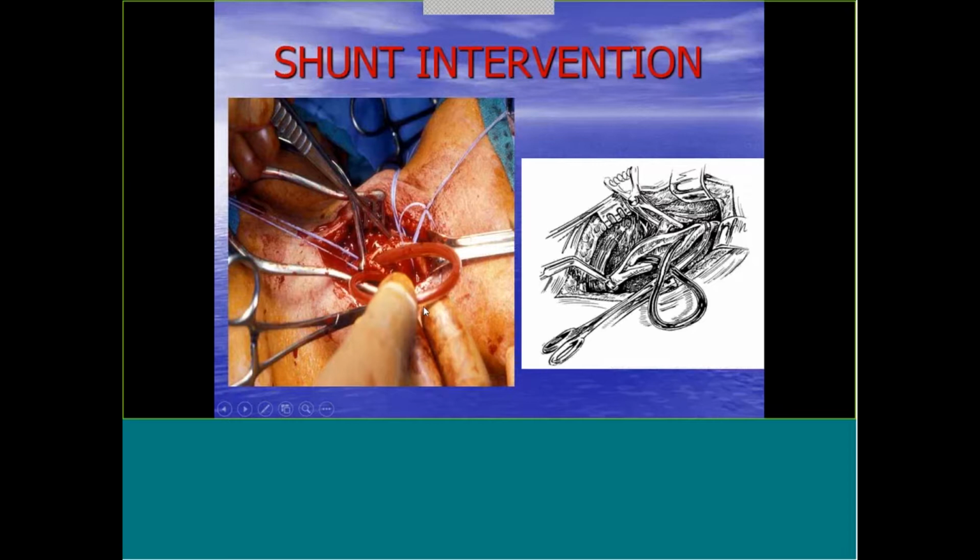Now the surgeon will take this tube and move it over here, move it back here, so that they can pull this plaque out all in one piece. Now keep in mind that this tube is going to be red. It's going to have blood in it regardless of whether it's kinked or not.